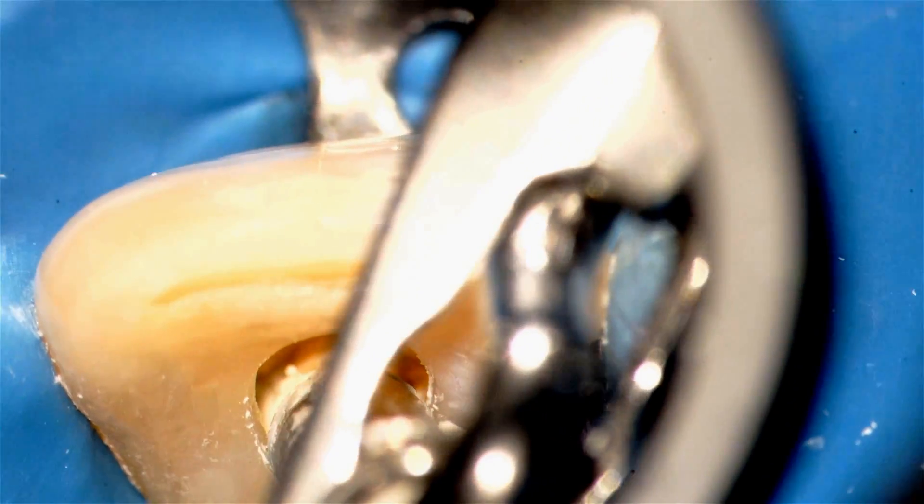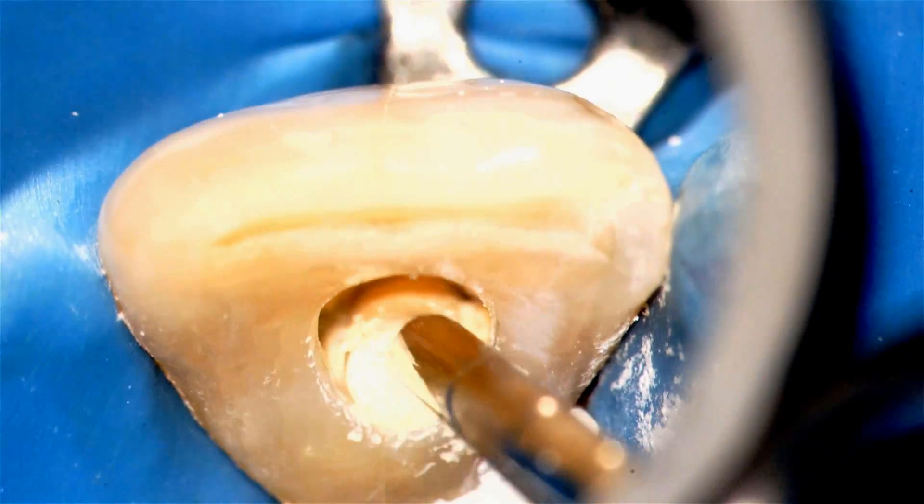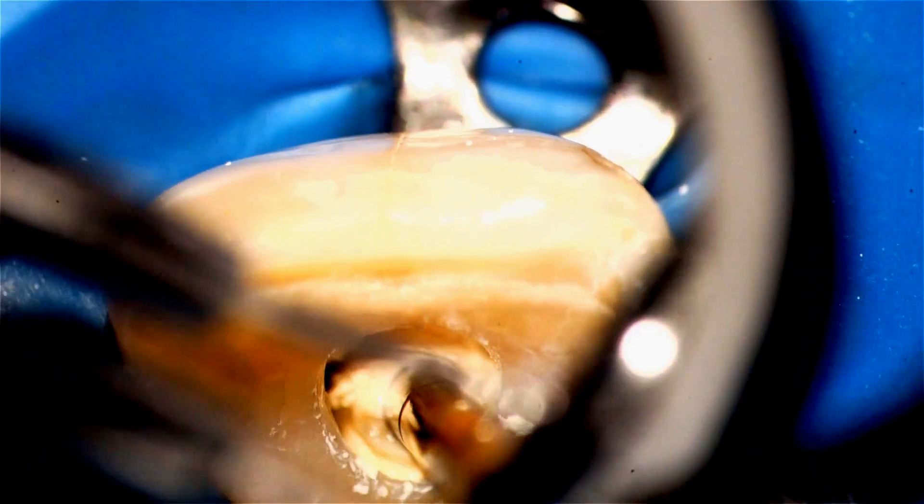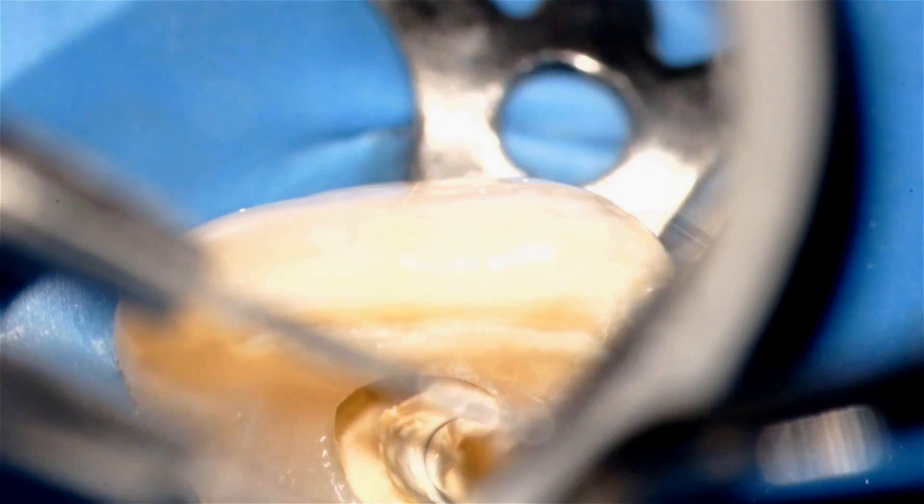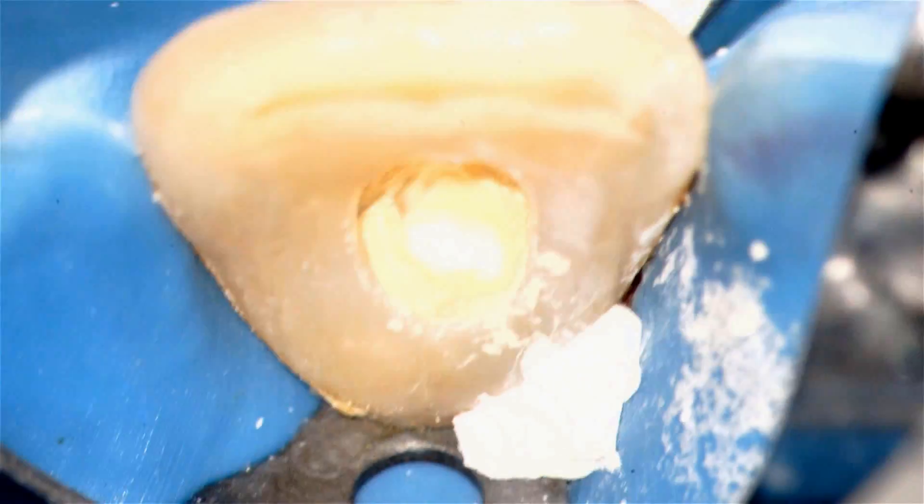There's the placed Biodentine, completely filling the resorption crypt, and now I place the Cavett on top of it. Now in this case, I did not want to place the core. Sometimes I'll place a Cavett layer and just place the core on top of it, but in this case, I wanted to have some bonded composite up higher to give this tooth some additional strength. There's the Cavett being squashed in.